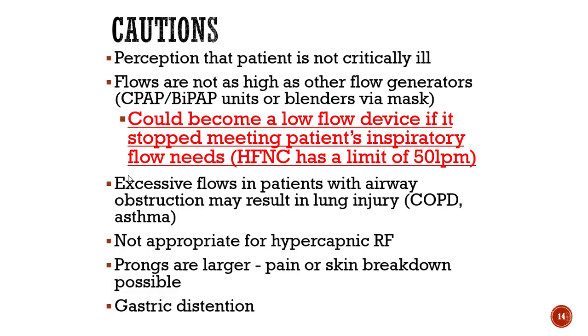This is from babies all the way through adults. If they're wearing a device for multiple days, you want to be putting in protective barriers, so skin protection such as Tegaderm or Mepilex, which you will see in the clinical setting. Try changing between a mask and a high flow nasal cannula if you can, to alleviate that pressure. With the little babies, they have a lot of breakdown because usually these are devices that they wear for quite a while and their skin is very fragile to begin with.